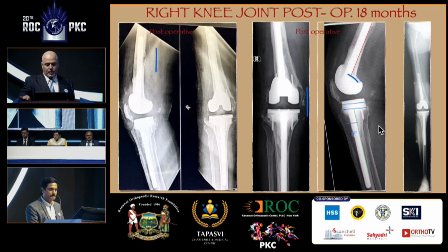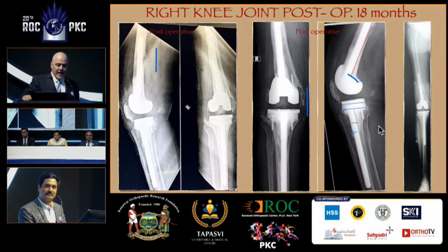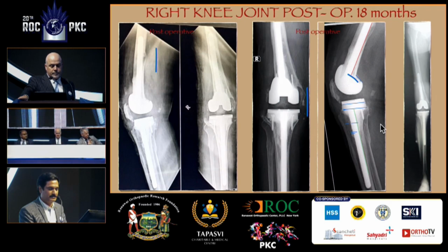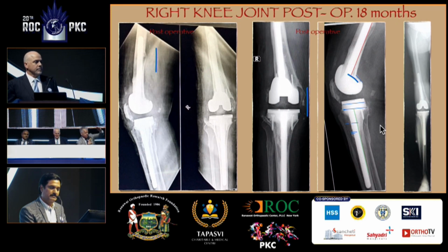All right, so you use bone graft on the femoral side. Yeah, I think now we're seeing the use of cones and sleeves for more of these defects rather than using, you use allograft? No, cement and screws. Just cement and screws, okay. Are you really happy with it? I mean, you changed the joint line dramatically. You have a patella baja. Probably this is a PS design. Probably severe instability as well. So why didn't you change the joint line better? You build up the tibial part.